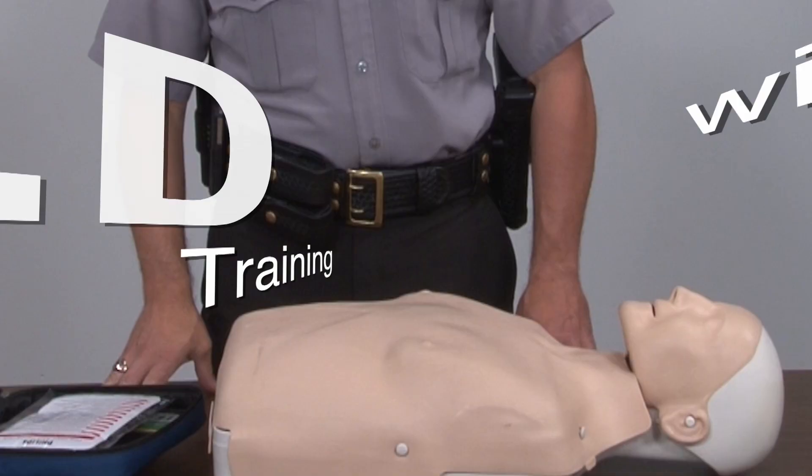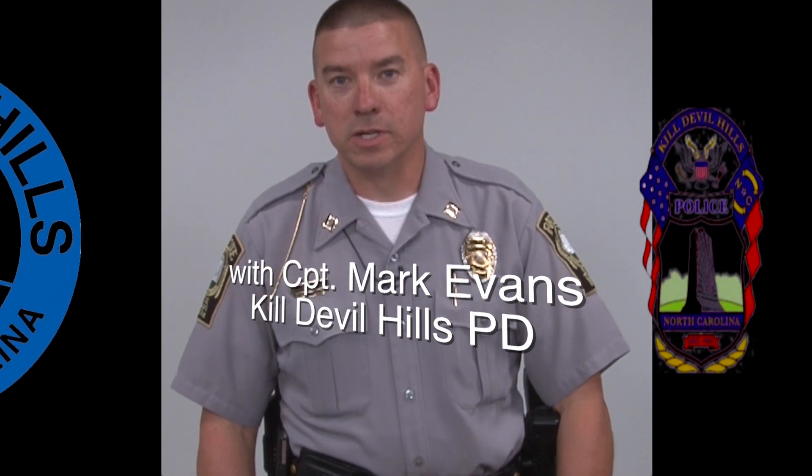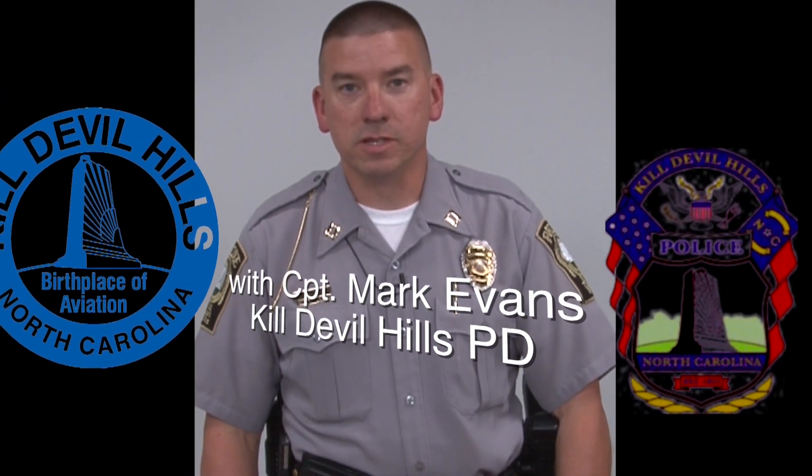Today I'm going to demonstrate the steps to go through for a person that is unconscious and in cardiac arrest. I'll be demonstrating CPR and also the use of an AED.